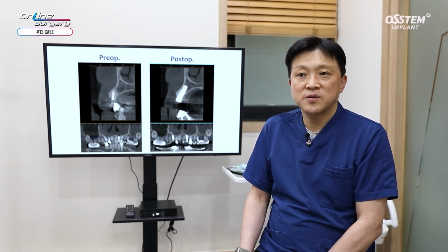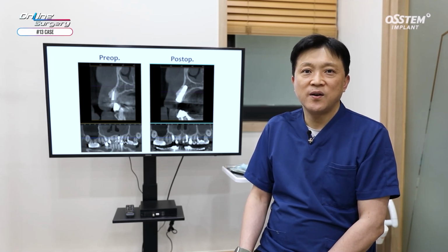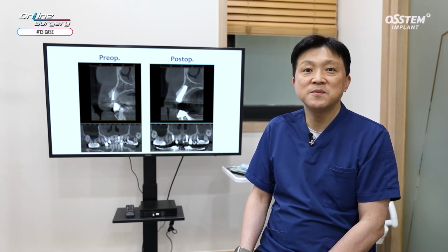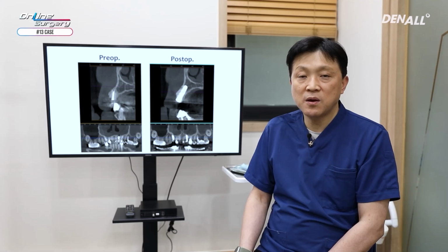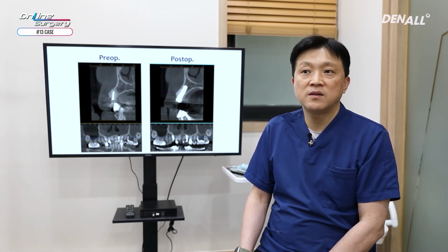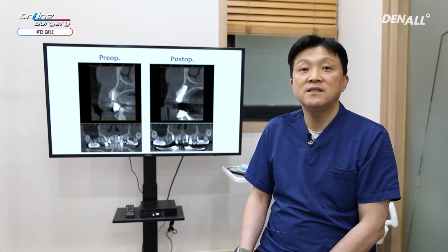Even in my case, when placing single implant in upper anterior, it can be quite difficult. In that case, if you place implant freehand, unintended errors can occur.